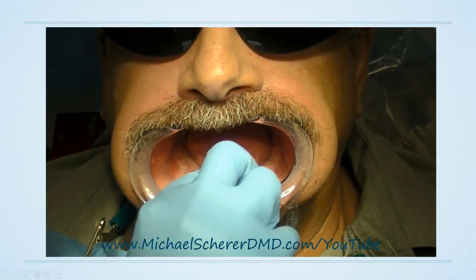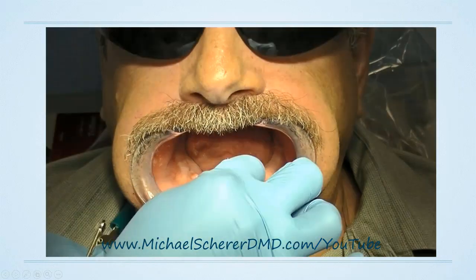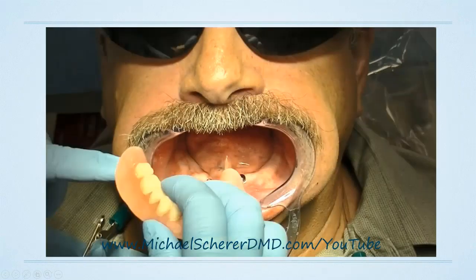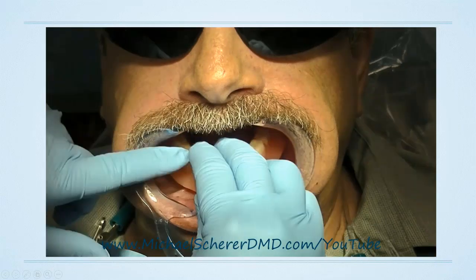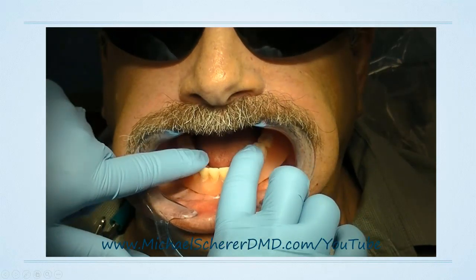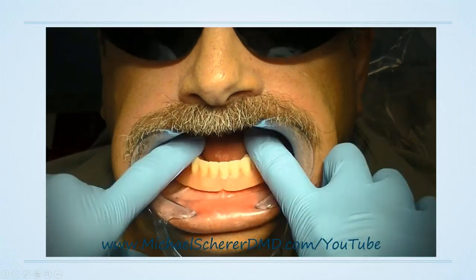What I like to do is take that just on my fingers and lightly tap it down over the edge. Don't push it down all the way. You want to see just over the edge of that little exterior prominence. Then I'm going to place on my housing itself.